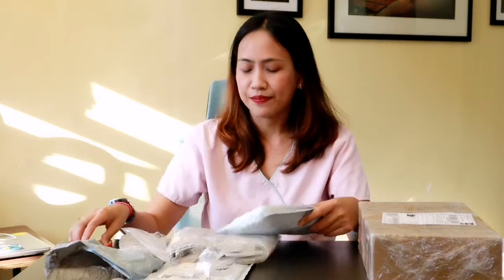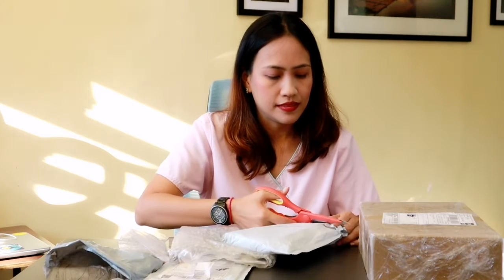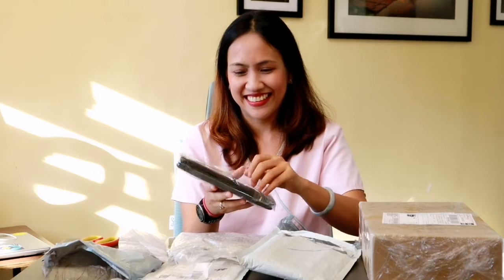Now we go to the third package, which came from Lazada. I'm happy because finally I was able to get the proper dental tools with the container or pouch that I wanted. If you viewed my previous vlog, I was quite disappointed not to get the pouch — I only bought that specific product because of the pouch, and without it I was a little sad. This time the supplier from China was able to send me the proper product — what's in the advertisement is the same as what the supplier sent me.